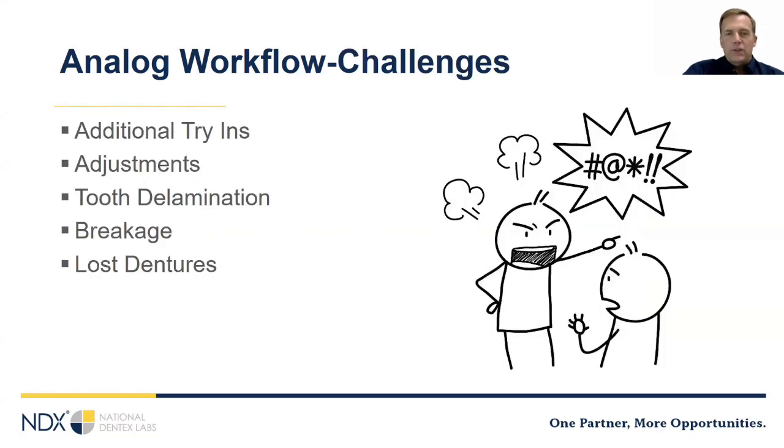So as you guys know, the current denture workflow was perfected in the 50s, and it can work seamlessly. Every once in a while, we get a case finished in these 5 appointments. However, if you do 5 45-minute appointments, you're oftentimes looking at $1,300 in office costs in addition to laboratory fees. At the current levels of insurance reimbursement, analog dentures just aren't profitable.